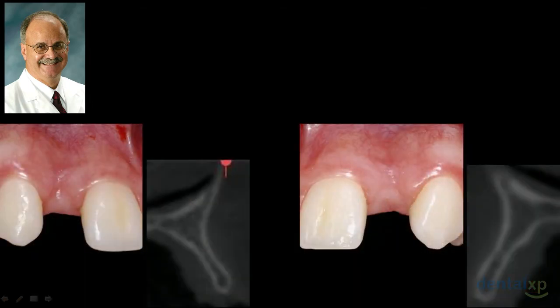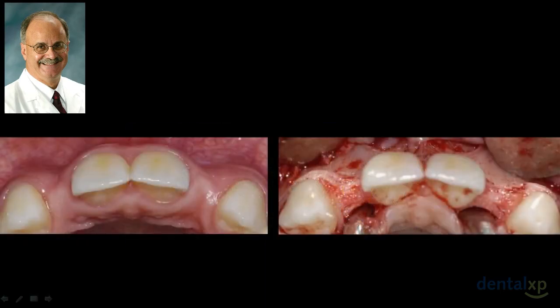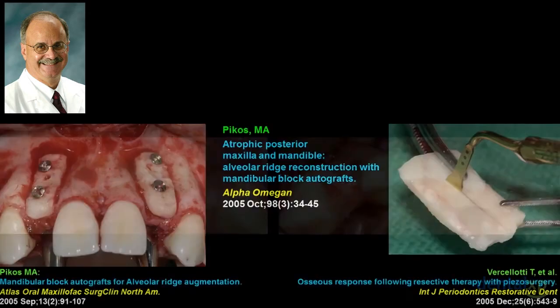The only way we can assess what's going on in terms of existing bone is with what? A sagittal CBCT section. That's it. Bone sounding PAs like we used to do, that only got us so far. Then we played off of what we found intraoperatively. This is a game changer, this technology. So we can assess what's going on in her case, a width deficiency, and it turns out to be a width deficiency only on the facial element. So that's interesting, and that's fine.